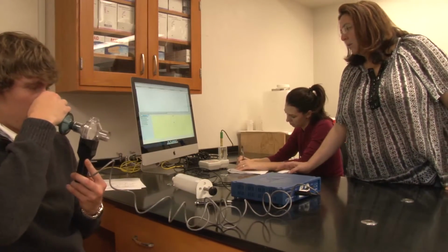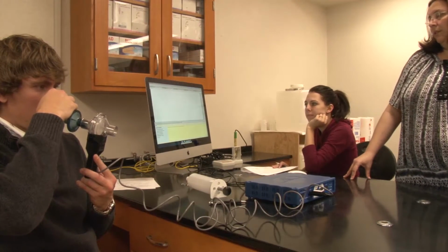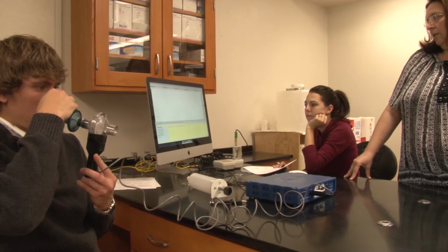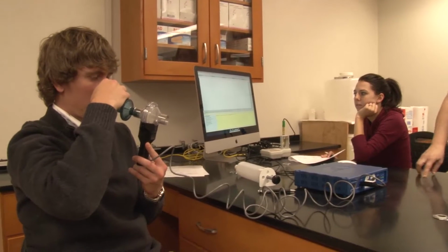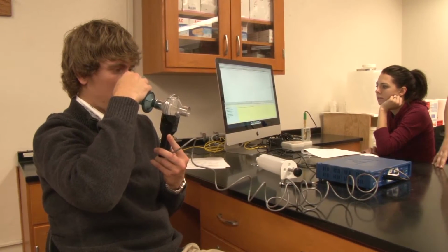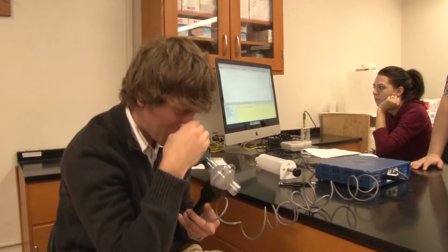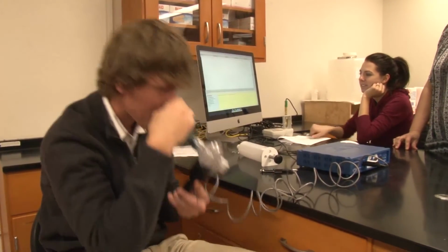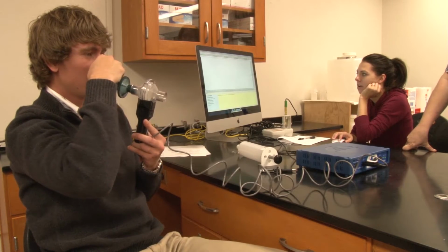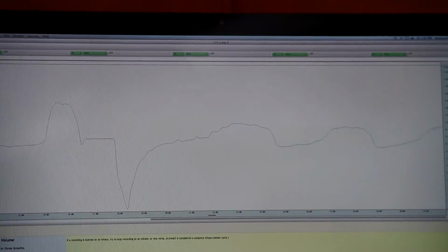All right, are we ready to start recording? All right, here we go. We're going to do 3 normal breaths first. Okay, that's 2. After this next one, we're going to do a maximal inhale. Remember, I want you to pick your shoulders and your chest up and hold it at the top. You ready? Go, go, go. Hold it. Go, all the way out. Good. Now 3 normal breaths. All right, press stop.